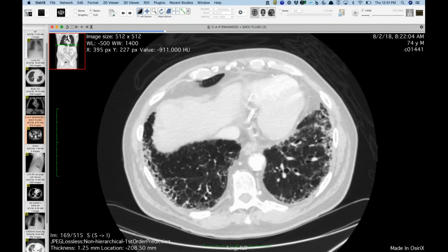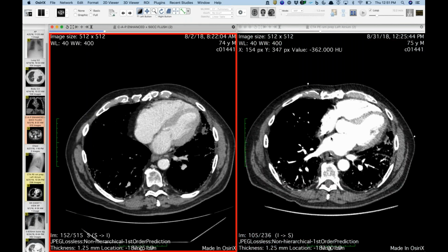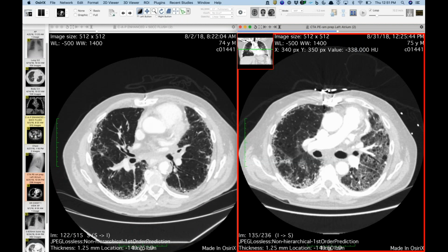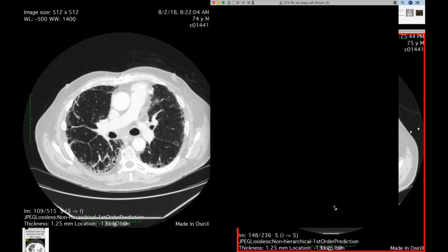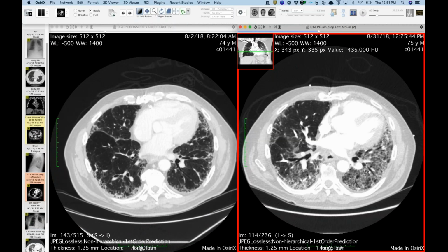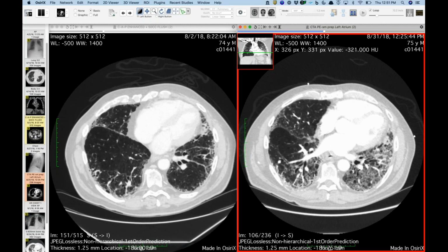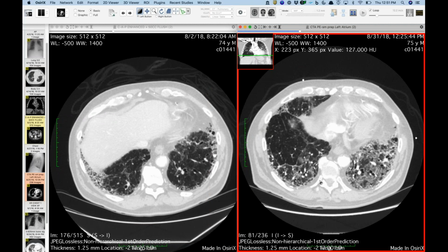And this is a couple months after the chemoradiation, at the beginning of August, and then he comes back in 4 weeks later and gets a PE protocol because he's acutely short of breath. And now you can see that he's got diffuse ground glass opacities superimposed on his underlying interstitial lung disease. And so we see these all the time because we have such a large ILD and pre-transplant population. And of course, the differential in these cases is always really some sort of pneumonia or infection versus acute exacerbation. And he underwent standard workup, he wasn't infected, he didn't have volume overload.